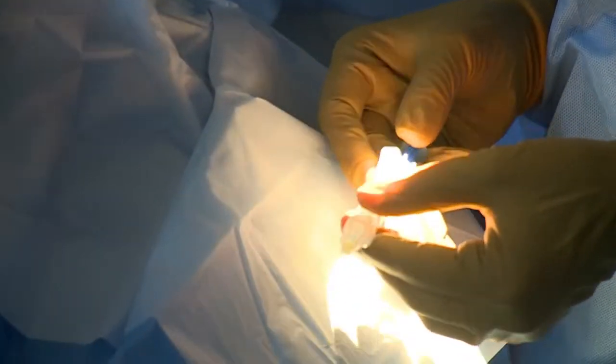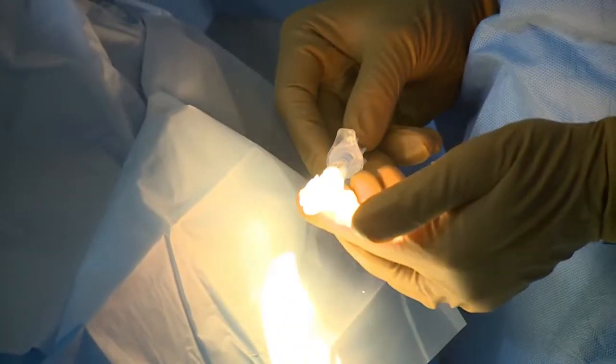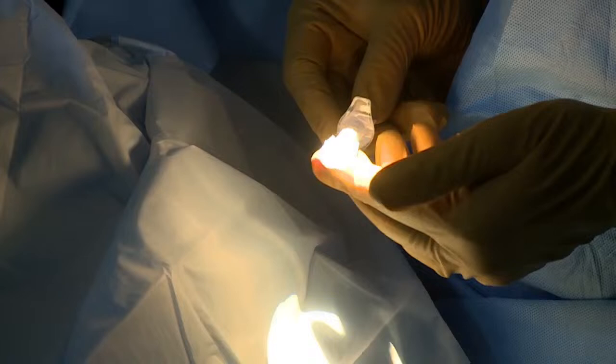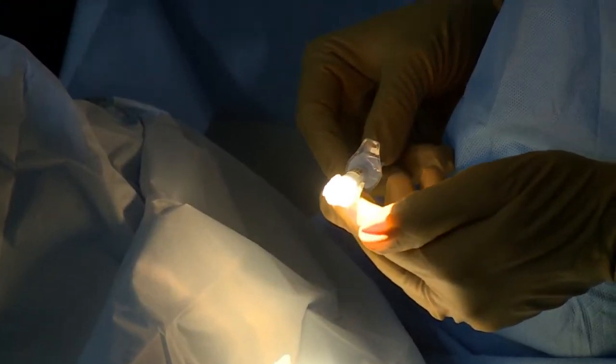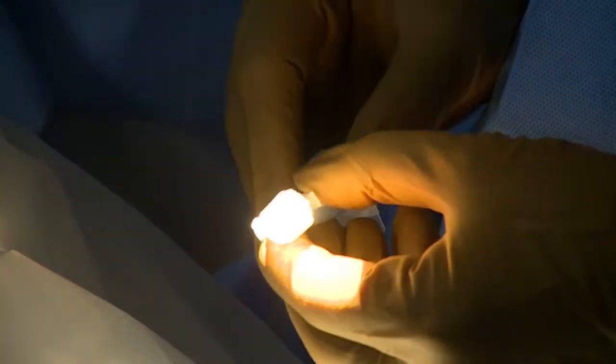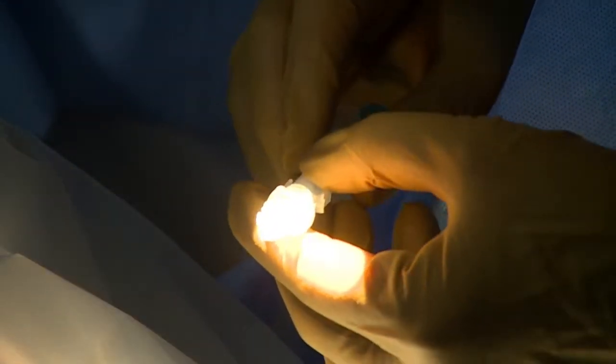So this is how you can see the injector now. It's a preloaded lens. You can see the lens is already loaded, and the tip you see is quite long, so you don't have to do the wound assisted. You can go inside and then inject the lens inside the bag itself.